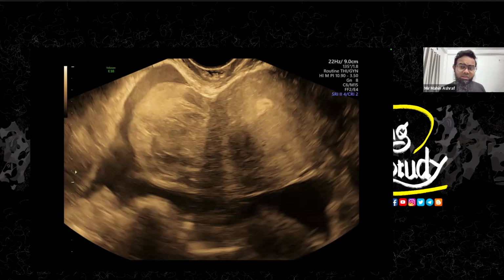If the density is relatively low, then it will get hypoechoic. But whenever I try to see the lower abdomen, I usually decrease the gain a lot so that it doesn't disturb the view of the adjacent areas. And you see, I frequently use Doppler. To use the Doppler, I usually want to reduce the gain to get a good result.